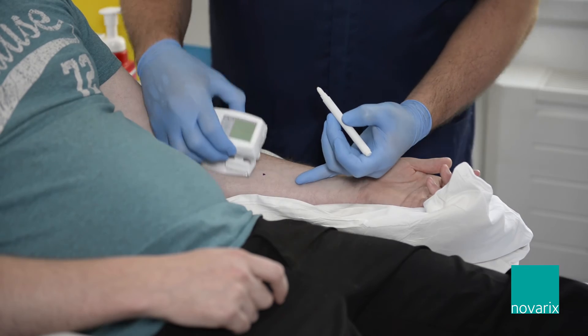Place the patient's arm in a good position if possible on top of a pillow, so that the IVI can rest safely on top of the patient's arm or the back of the hand wherever you are using the device, so that you can then assess the patient's arm with and without a tourniquet.